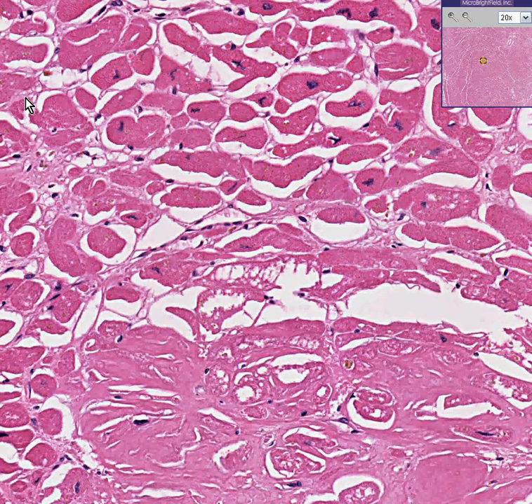Amyloid can fill up any organ and can cause damage if there's enough of it in there. Amyloid is deposits of immune protein which build up over the years for various reasons. Amyloidosis of the heart in enough quantities can cause the heart to fail and can cause arrhythmias.